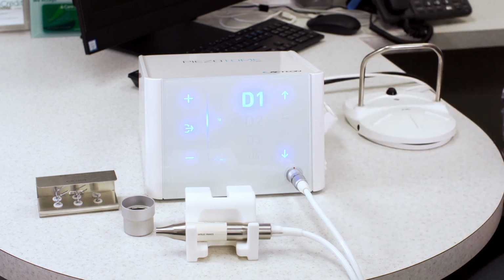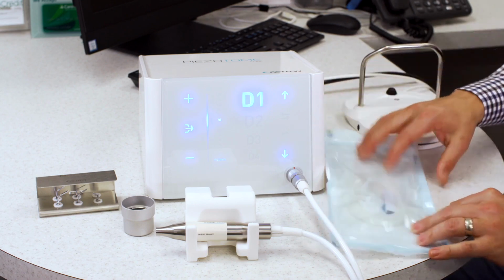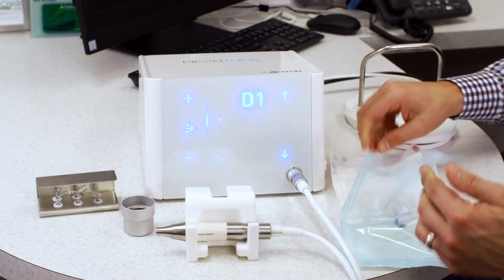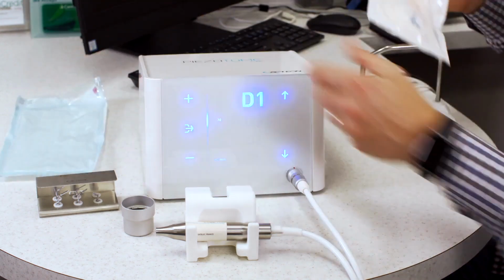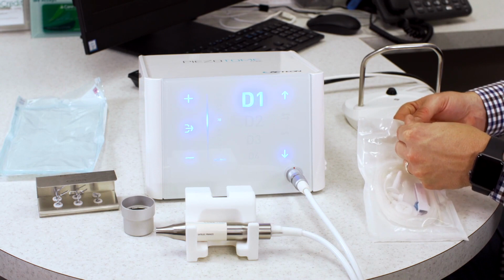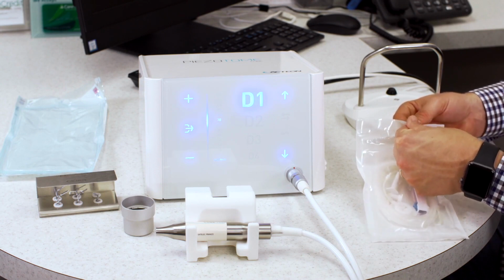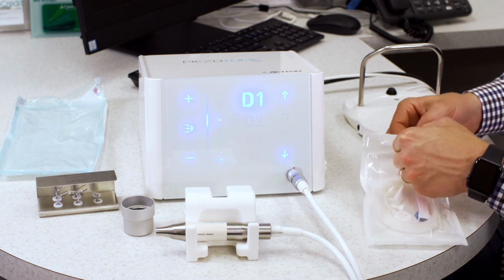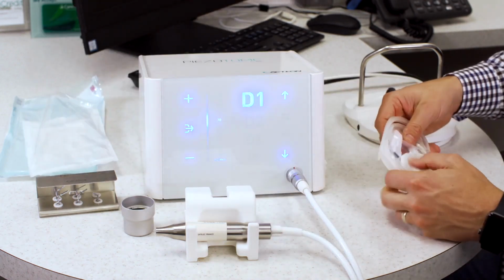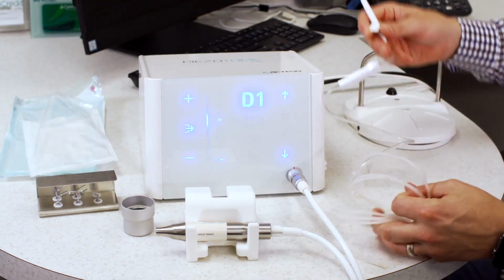For the water, it does take a special type of tubing, which is very specific for this machine. The tubing is different than your tubing for your implant handpiece motor. These have to be bought through Acteon, I believe. I'm sure you can buy them through other markets as well, but it's very specific for that.